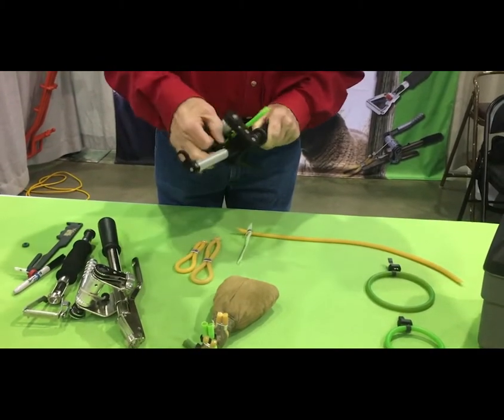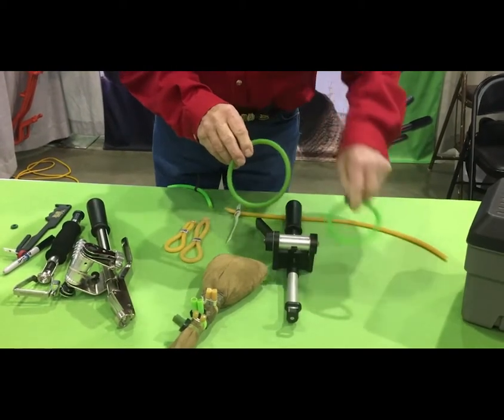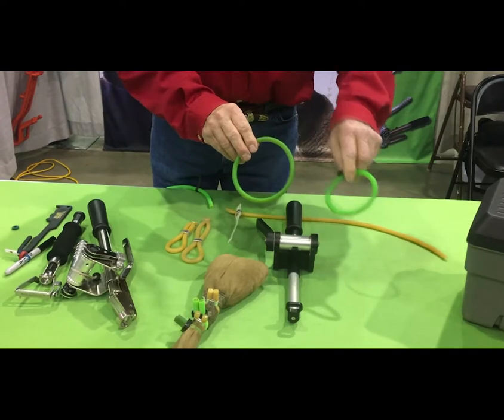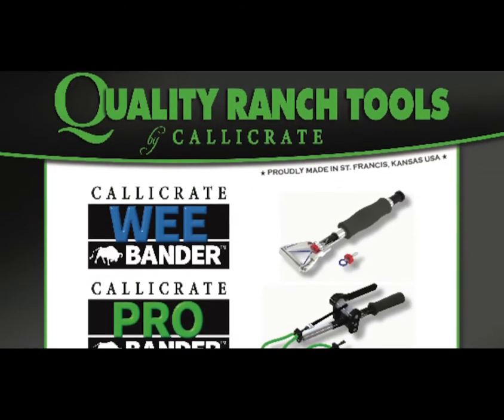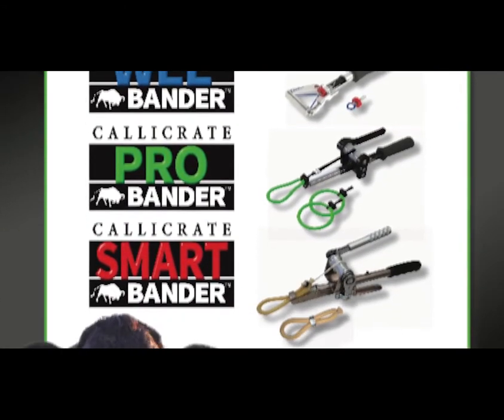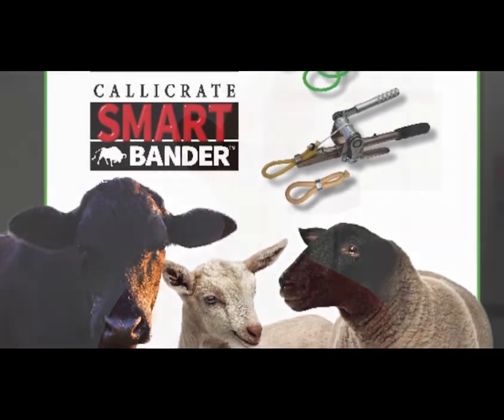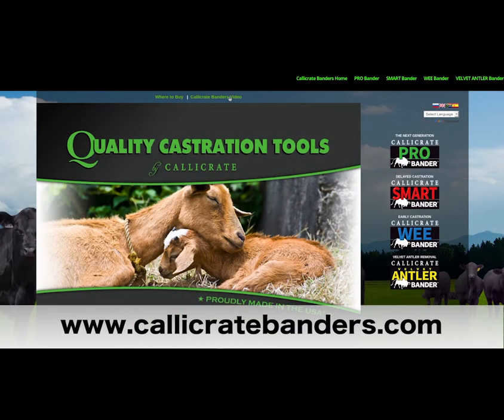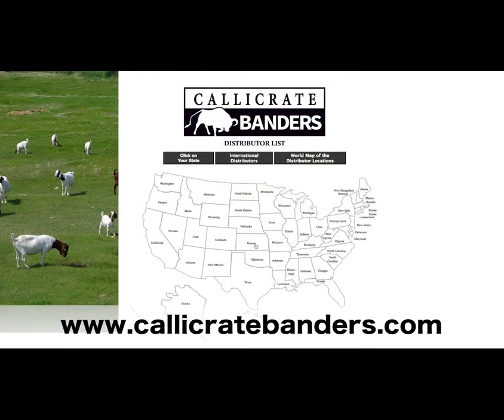We also make a larger band with that one that we call the prolapse band, so you can use that also on those larger tissue masses. Those are the main products that we have for the Callicrate Banders. We'd be glad to show you anything. You can get a hold of us at callicratebanders.com and watch our videos. You can see instructions on how to do all those things, and you can find all of our distributors on that website.